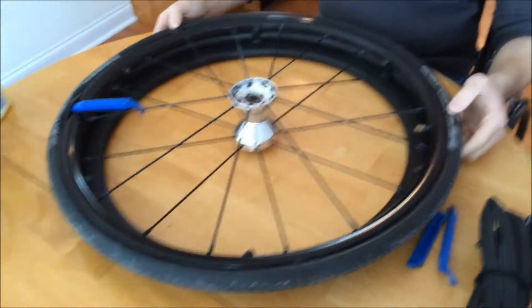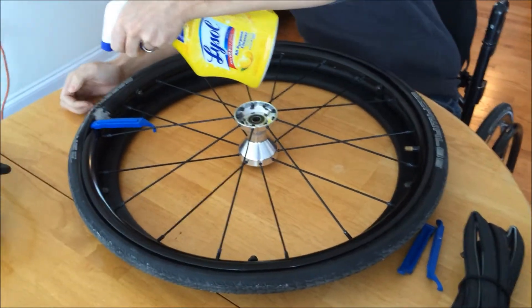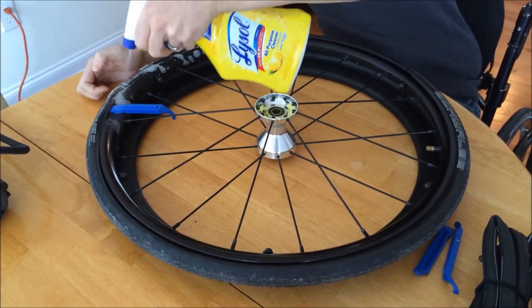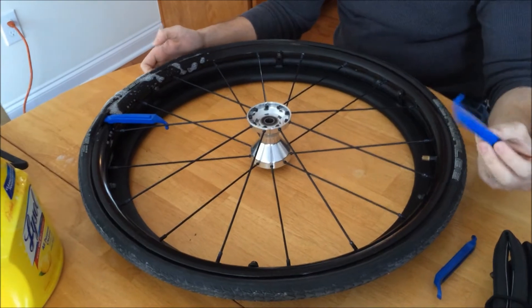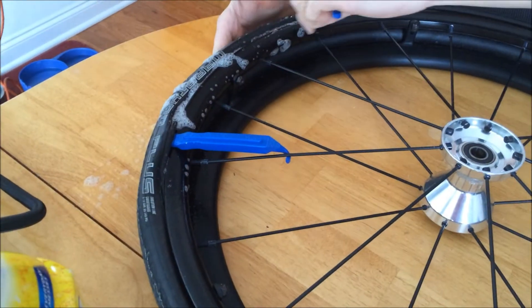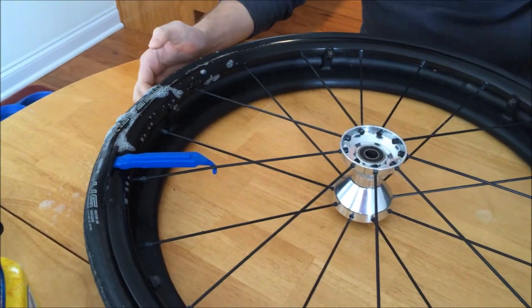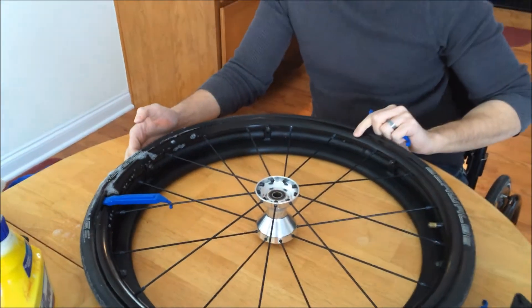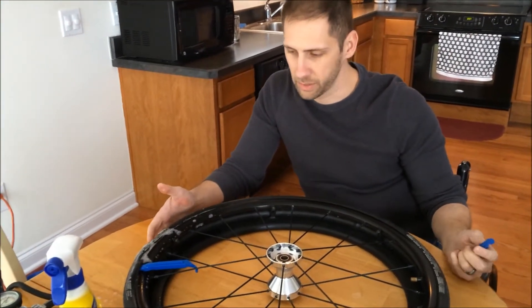These Marathon Plus tires are a lot stiffer than a typical bike tire, so I just like to use some kind of lubrication to lube it up. What you're going to do is work your way around with one of the other tire levers and just kind of pull along this edge until it works all the way around. One note: you're actually starting on the back of the wheelchair tire. You wouldn't want to do it on the front because the push rim is on the front — it would get in the way.